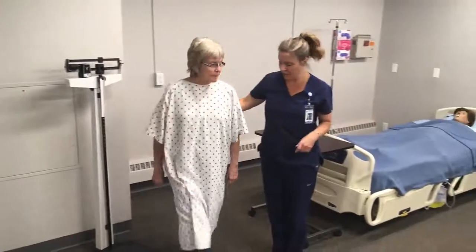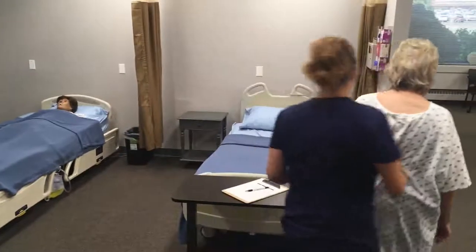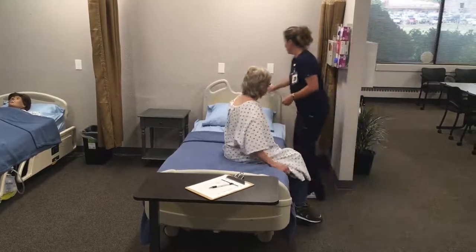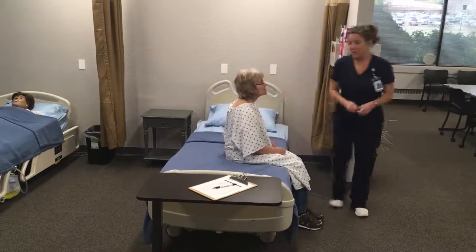Good. I'll walk back over to your room. Now have a seat on the bed. I'll give you a call light. Okay, I'm going to wash my hands.